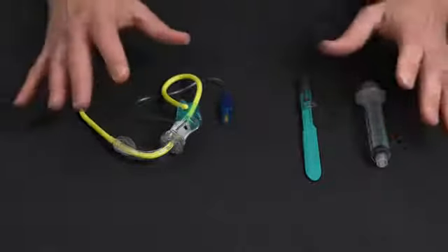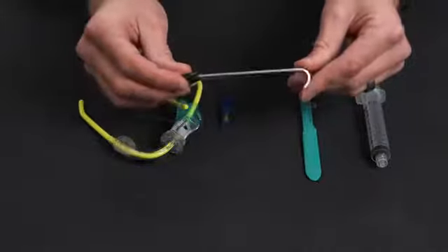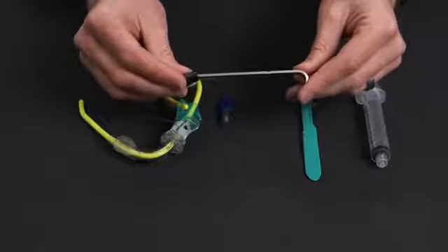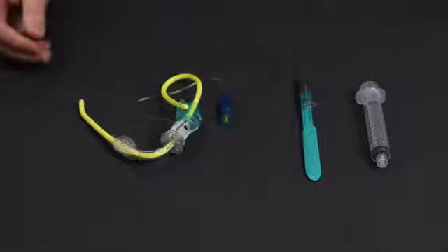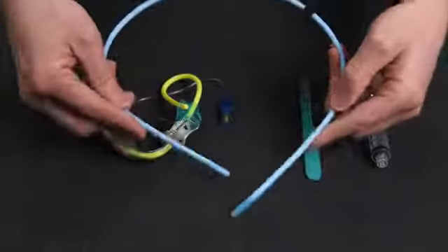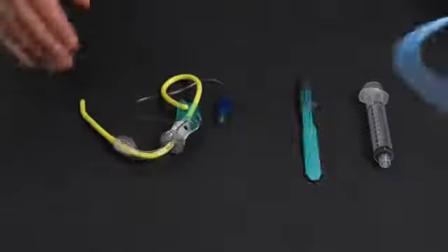Like I said, there are a lot of different devices for doing this procedure. You can have a tracheal hook, which can be used to make this a little easier. I've found that this kind of complicates the procedure and I don't generally use it, although we can talk about its use a little bit later on in this video. One thing to mention here that I kind of glossed over is when you're looking at the bougie to use, you can use a normal adult ET tube bougie. I like the shorter ones for this because once again, it's just a little less cumbersome.